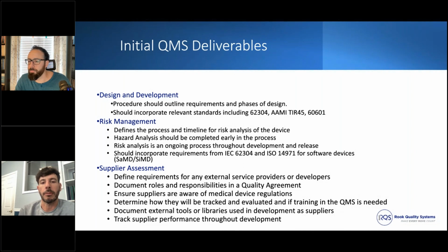So for software features, if there's a risk of data loss or using patient information, there should be appropriate cybersecurity and testing in place to show that those risks are reduced and you've validated that the software device can maintain the security of this information.